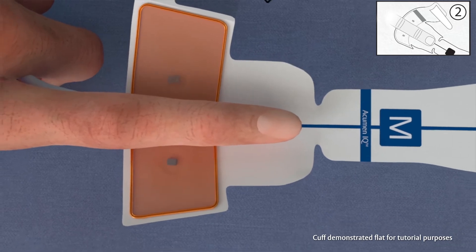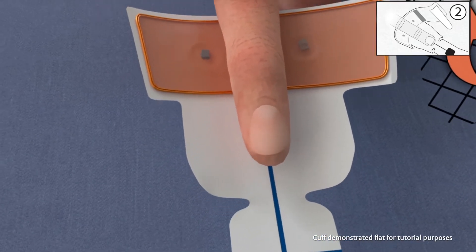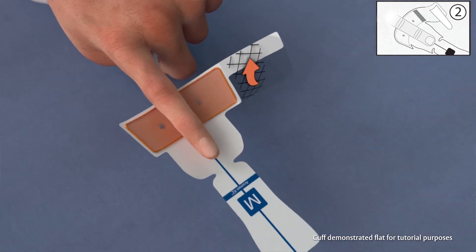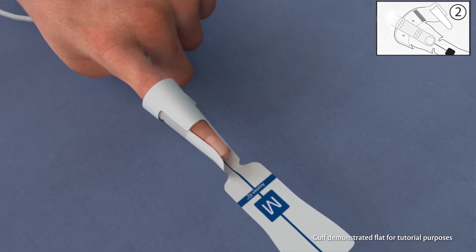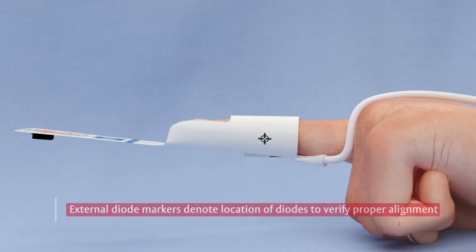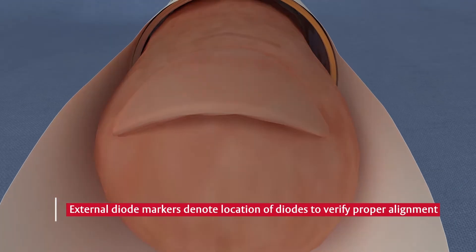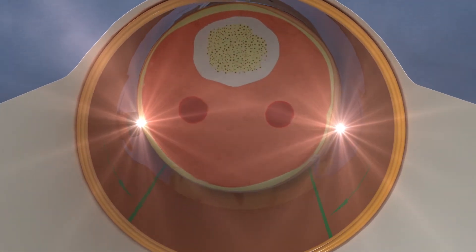Align the distal end of the finger with the center line of the alignment tab on the AcumenIQ Finger Cuff. Allow the AcumenIQ Finger Cuff to close around the finger. External diode markers on either side denote location of diodes to easily verify proper alignment.